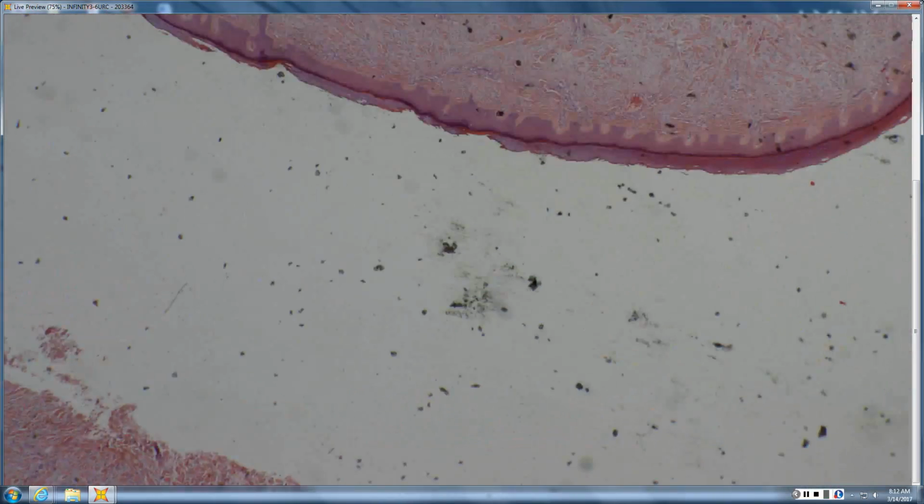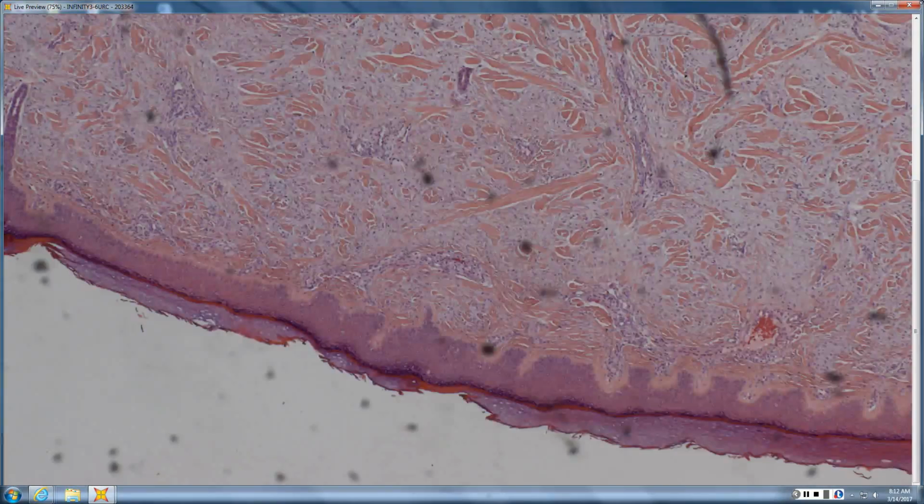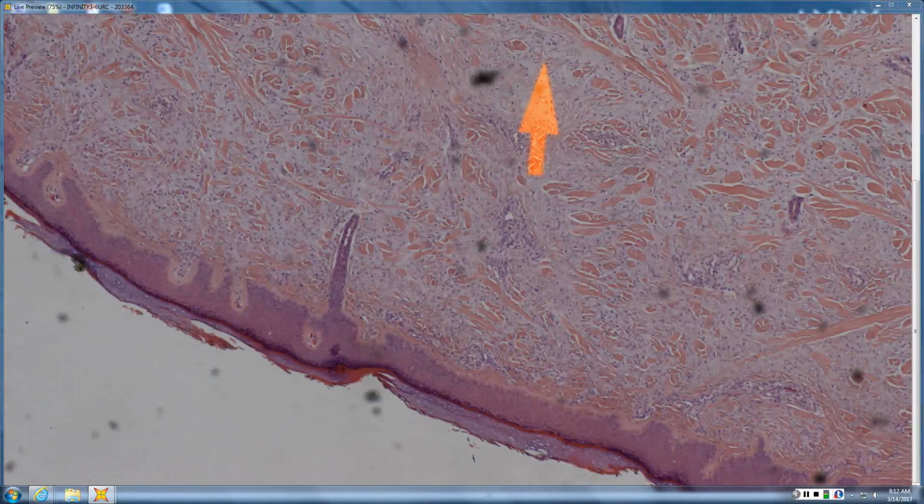So acanthosis of epidermis, maybe even on acral skin. Yeah, so maybe on acral skin. And how would you characterize the proliferation? Histiocytic. Histiocytic, any particular color to the... Oh, they're like histiocytes?